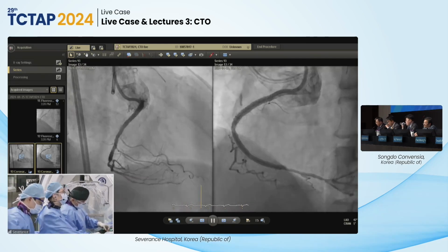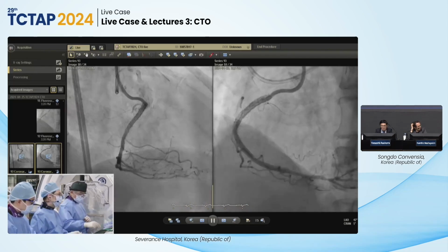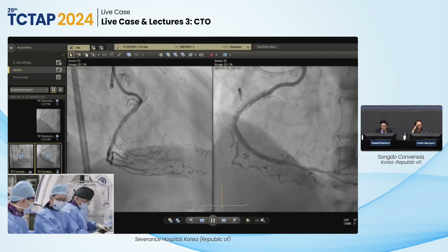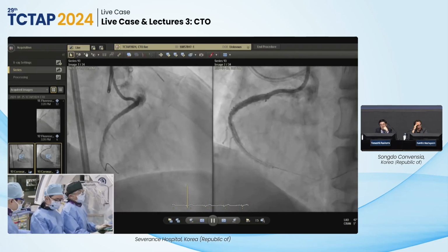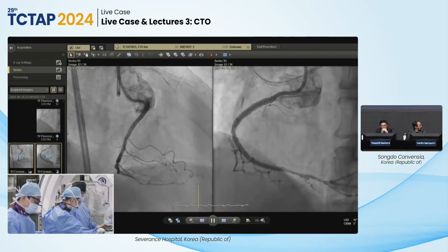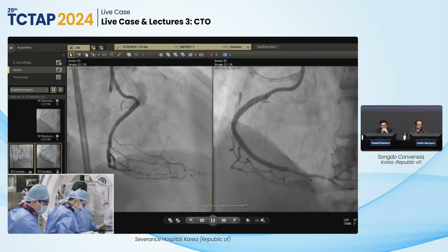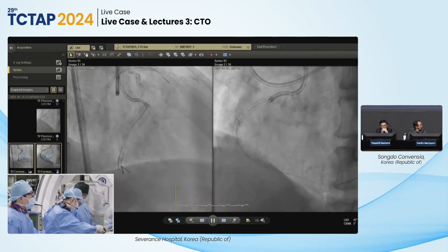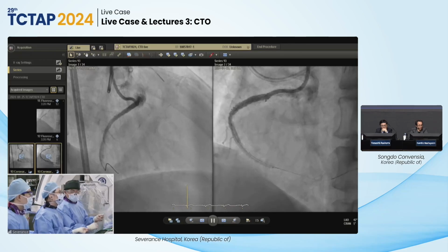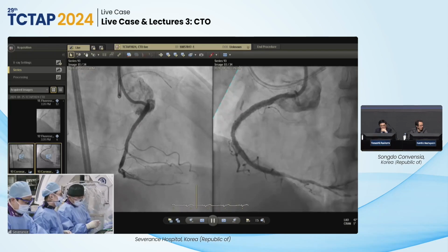What you said is regarding that sometimes we're just treating the angiogram. We really have to think about that. So I'm really looking now at IVUS because I didn't get that before. What we try to avoid is that we just go in with a balloon, then we might have an edge dissection there, for nothing, and probably there is no need for it. And then you have another, let's say, 24 to 26 millimeter stent length. And flow is good, so let's see what IVUS is showing. If there's some soft plaque and the plaque burden is not more than 50%, probably we can just leave it.